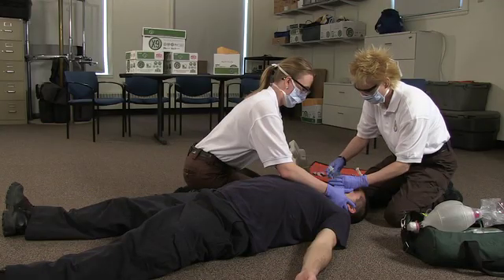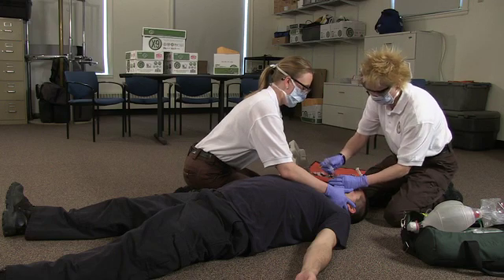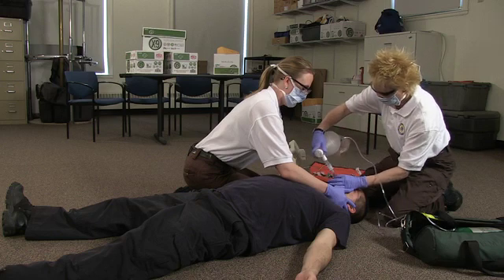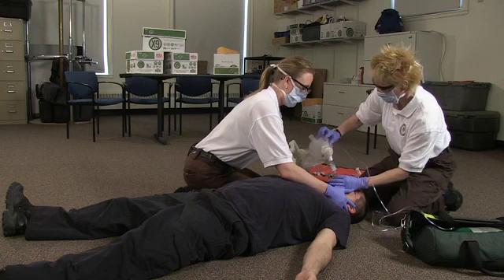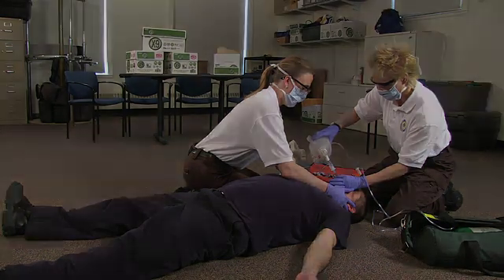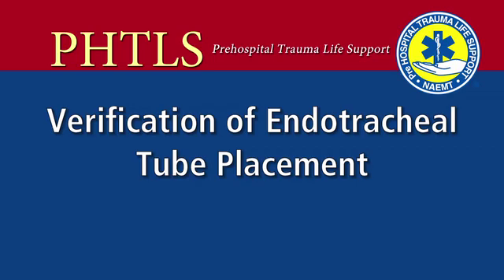Next, a bag mask device is attached to the endotracheal tube along with an end-tidal carbon dioxide monitor when available. The patient is ventilated with the bag mask device. The placement of the endotracheal tube must be verified. Verification of endotracheal tube placement.